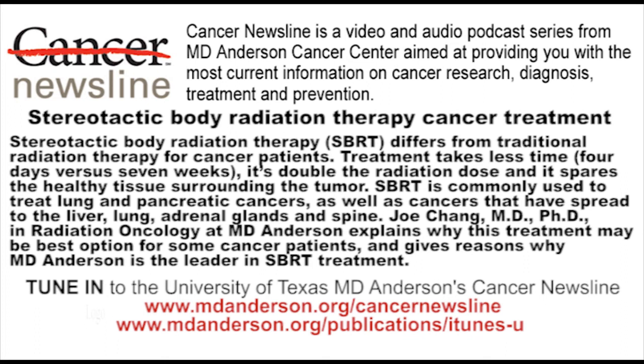So should patients that are possibly eligible be asking about SBRT? Is that something they can ask their oncologist about? Sure. If they have early stage lung cancer, if they have a recurrent lung cancer that recurs in the lung parenchyma, or if they have metastatic disease to the lung, liver, or adrenal, they should ask the physician whether SBRT is another option, and then get a consult from a radiation oncologist, and we can give you an assessment to see whether you are a good candidate for SBRT.